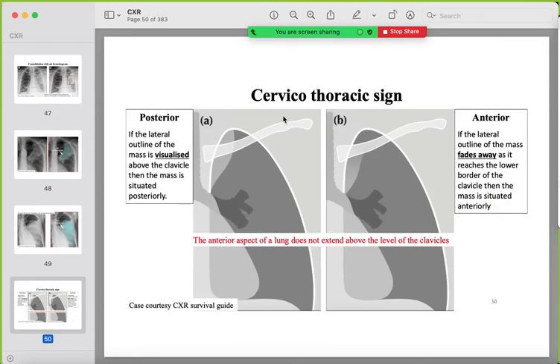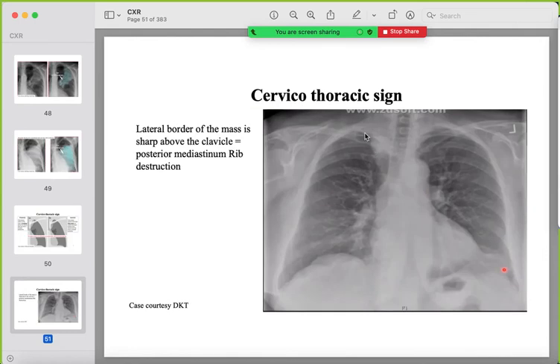The cervicothoracic sign occurs with an upper lung zone mass. If the lateral border of the mass is sharp above the clavicle, the mass is in the posterior mediastinum. If the lateral border fades away above the clavicle, it is in the anterior mediastinum. Example: a right upper lung zone mass with a sharp lateral border above the clavicle indicates a posterior mediastinal mass; rib destruction at the second rib posteriorly may also be seen.